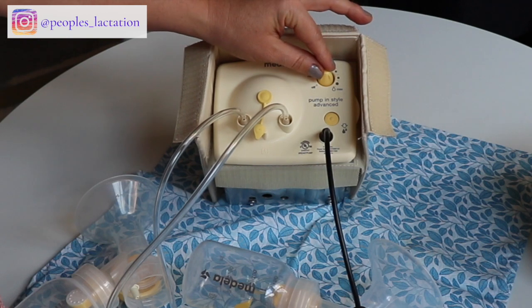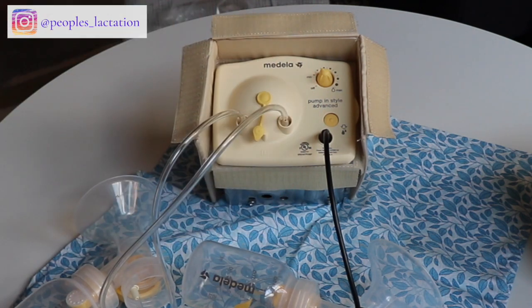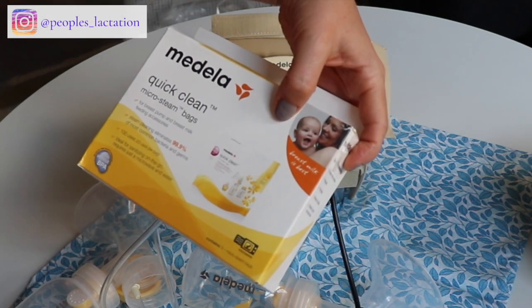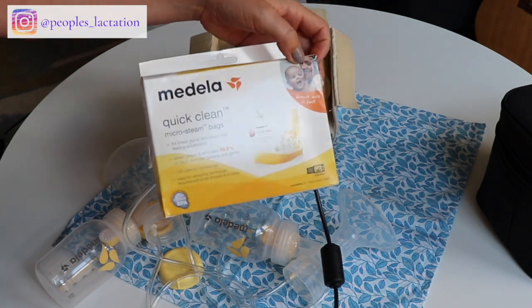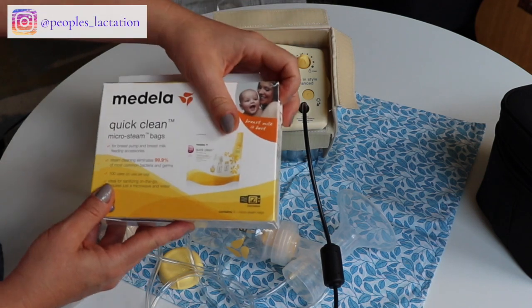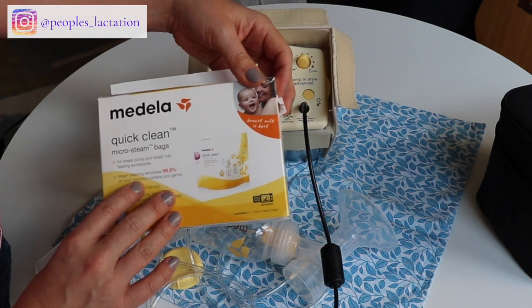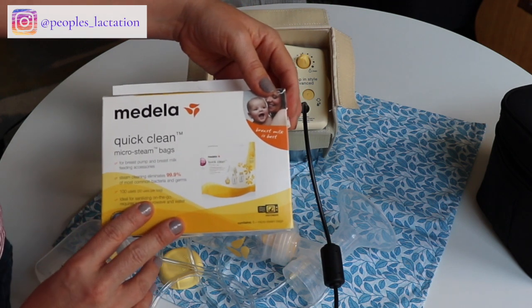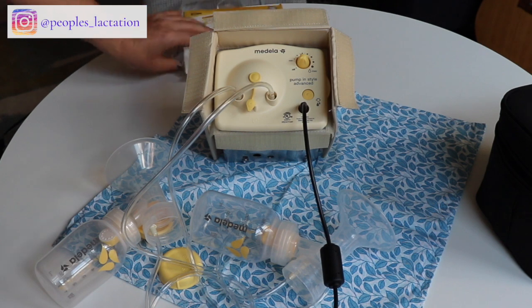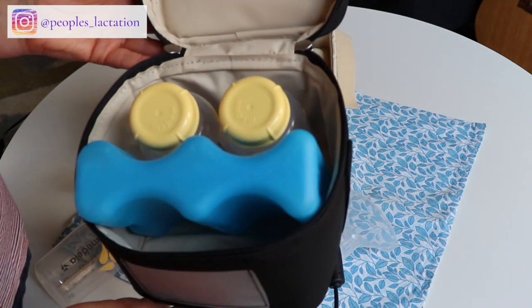For sterilizing your pump parts, sterilize once a day. You can throw most of the hard plastic parts in the dishwasher or use a bottle sterilizer. Medela also makes microwave steam bags — you throw the parts into one of these bags with a little bit of water and put it in the microwave. The bags are good for 20 uses each, so that's something to consider.